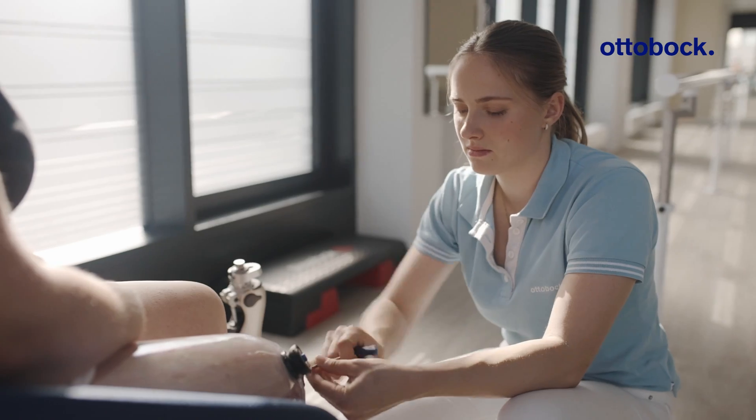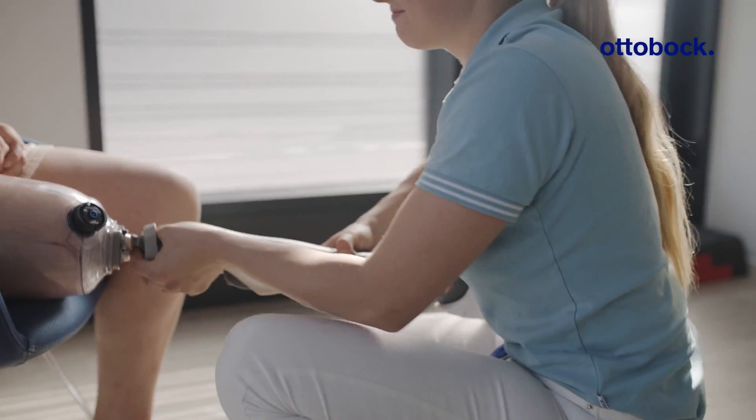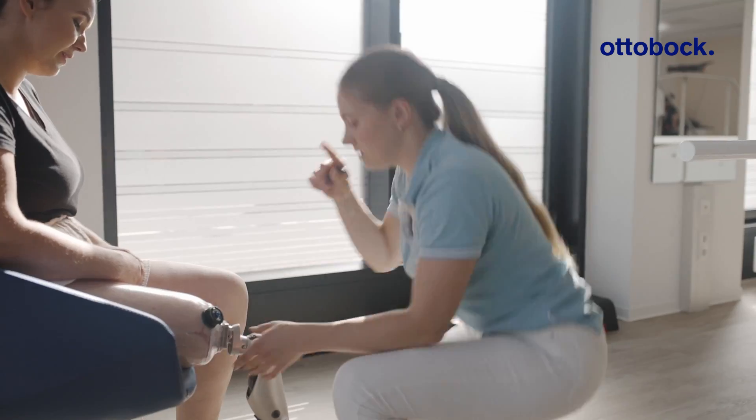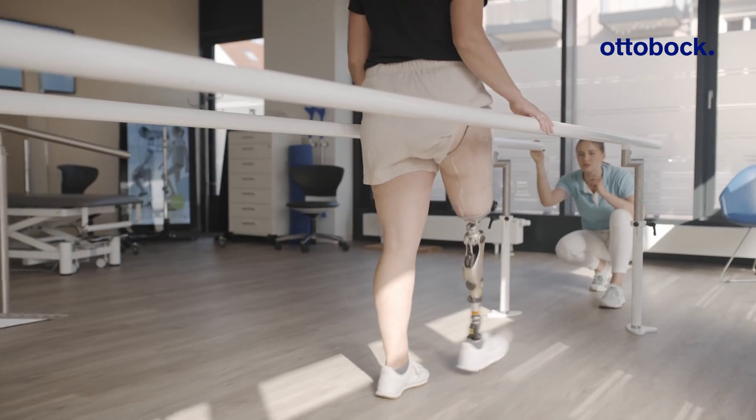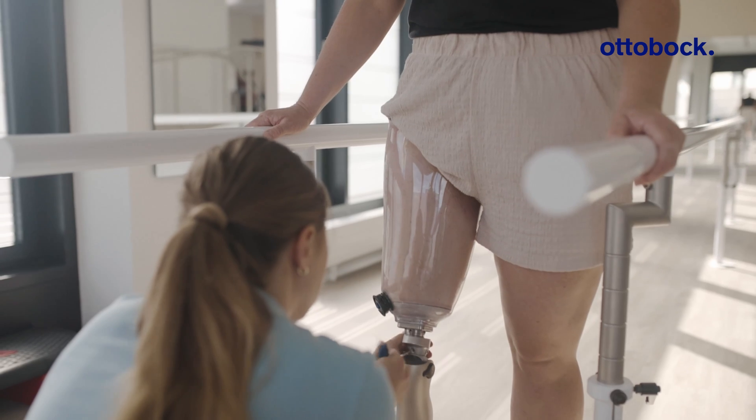For me, the most important thing is that the socket fits, because it's all very well having an excellent foot and knee. But if the socket doesn't fit, it will hurt and won't work properly. It is uncomfortable and exhausting. The socket is really the most important element.